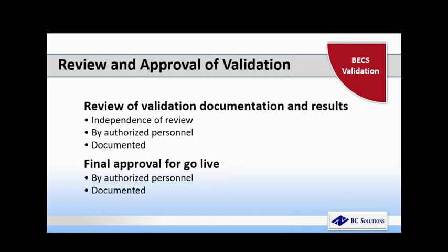Now realize that I've stated all this. Whether or not you perform this in-house, all this documentation should be done. If you are contracting a third-party vendor, all these elements should be met in their documentation. But for the review and approval, even if you contract with a third-party vendor, your facility is responsible for reviewing the documentation that's provided for the validation and ensuring that all of this is correct.